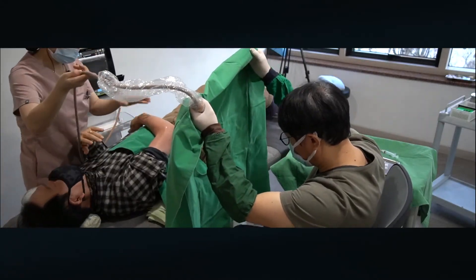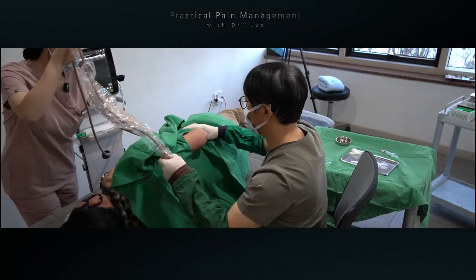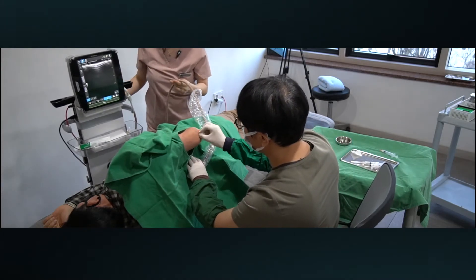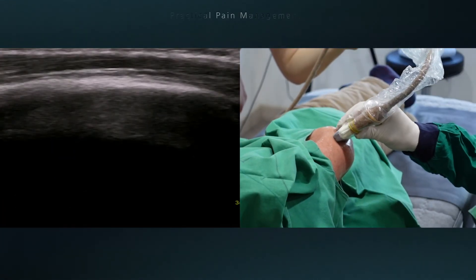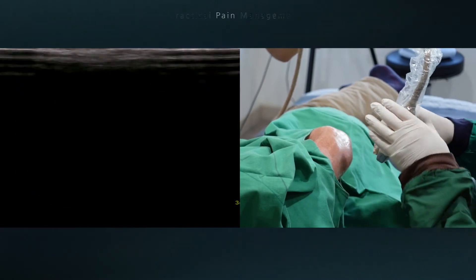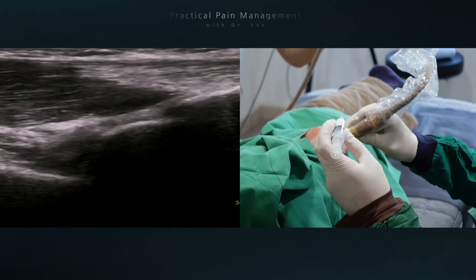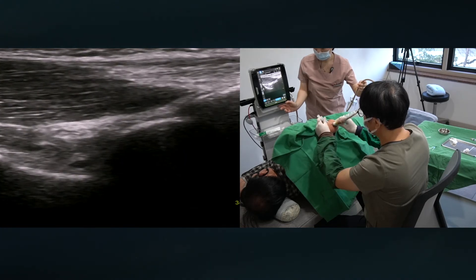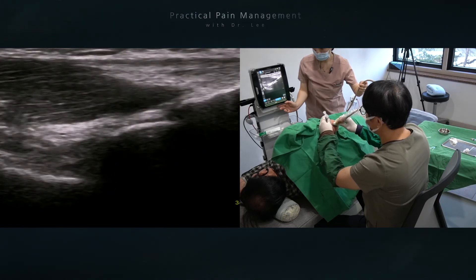Now I'm going to move to the intra-articular injection. My staff and patient cooperate to make a suitable position. I have to clean the surgical site with alcohol chlorhexidine solution one more time.